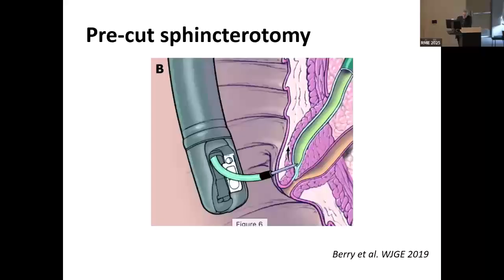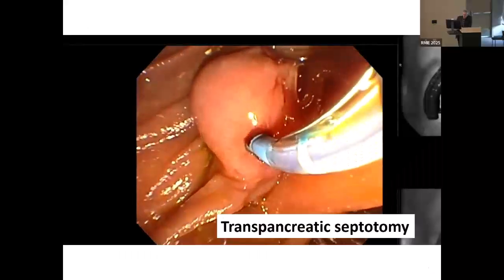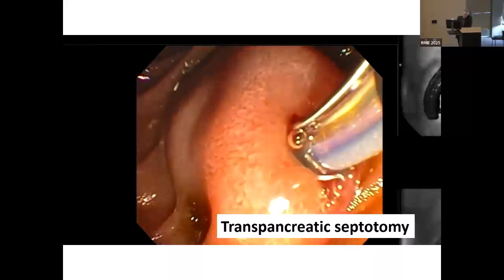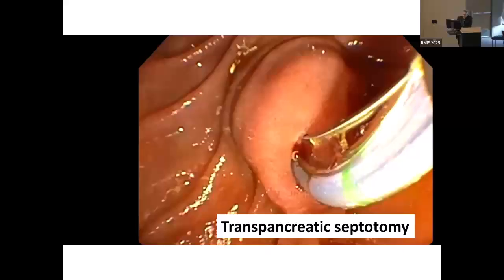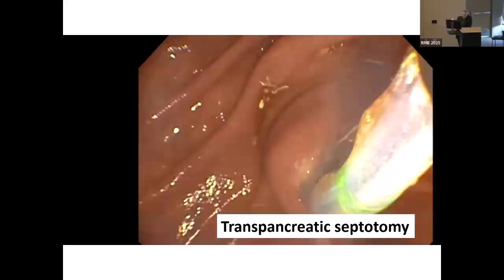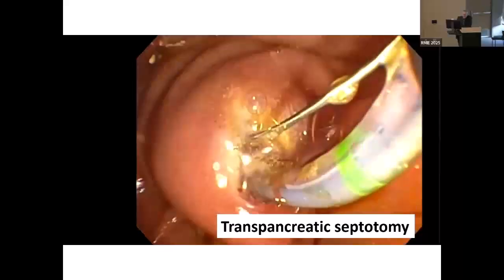Okay. So moving on to pre-cut sphincterotomy, let's talk about the transpancreatic septotomy first. This may be helpful in this case. As you can see, you start from the main opening, and you may have gone into the pancreas once, and then proceed by opening the ampulla gradually. You can do it either freehand with a pre-cut, or with a sphincterotome, and then move up and gradually see if you can find the opening of the biliary tree.